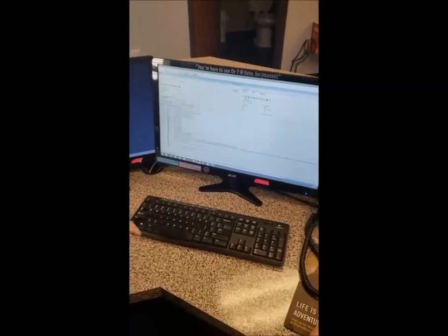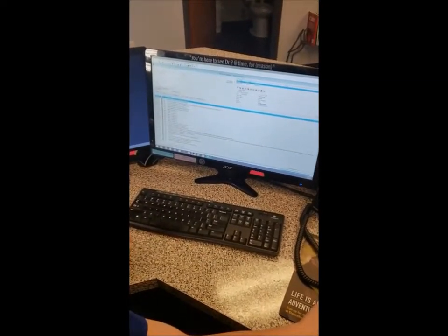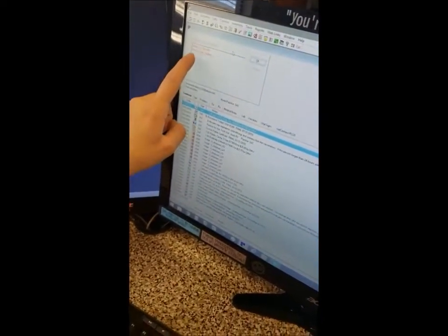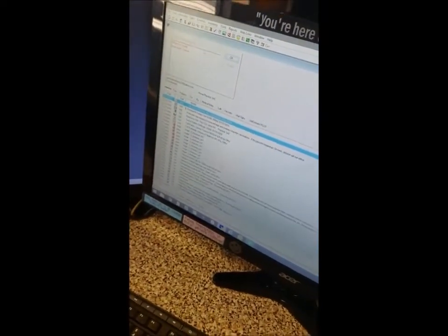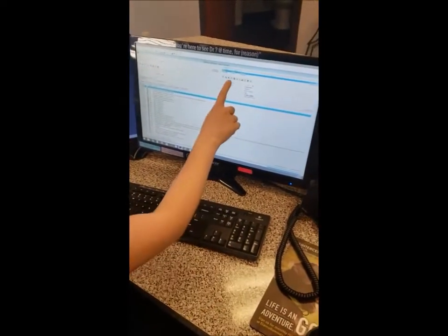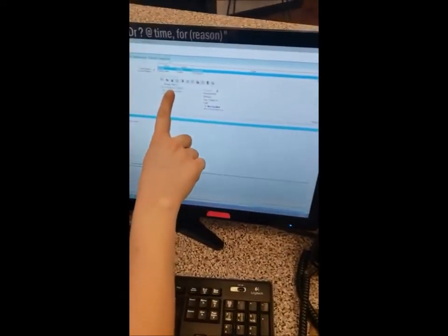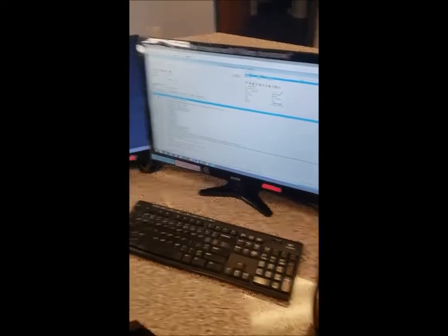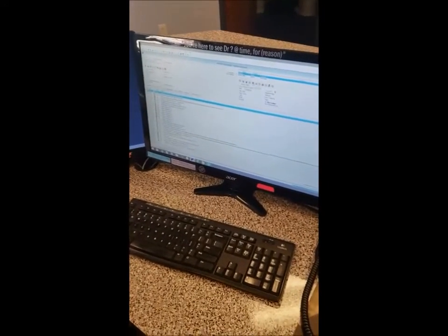So if there were a patient alert, it would show right here. So this patient is allergic to penicillin, and he's also a diabetic. And so this would also show the signalment as well: 14 pound, 6-year-old canine dachshund named Bentley. And so we could print this out and it would show on the bottom of the form, patient is allergic to penicillin and is a diabetic.